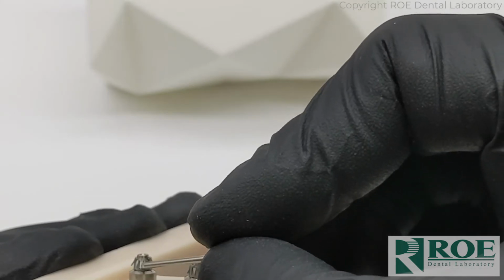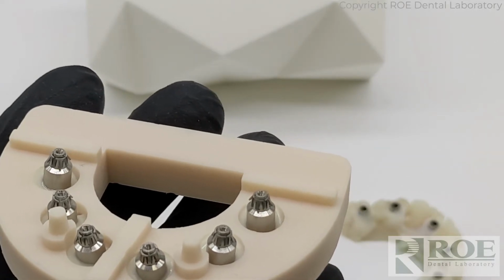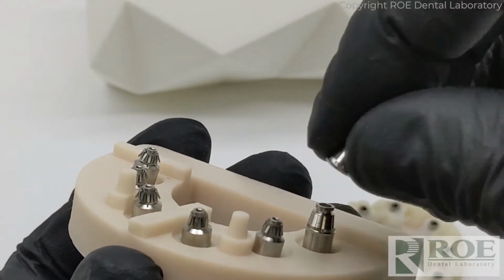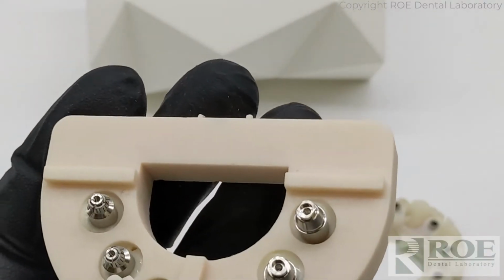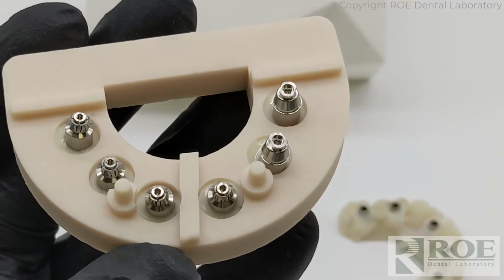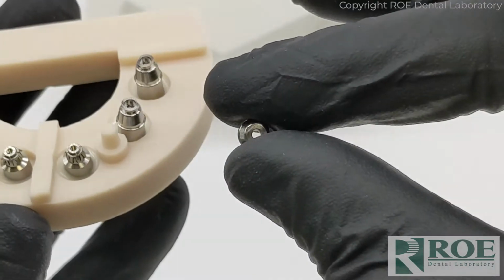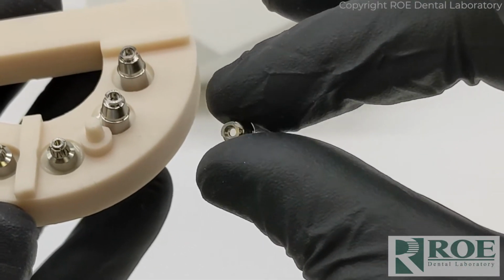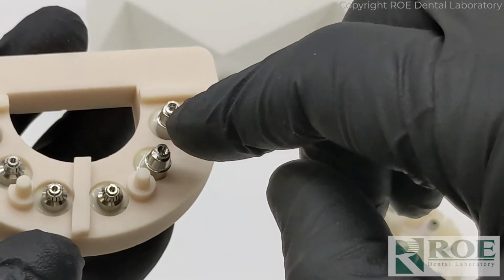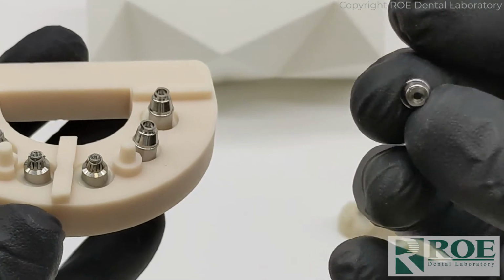See how easy that one spins? Some of them spin a little easier than others, but once they're all in, then we'll put the copings on top, like that. All 6. And one thing that is very important is that you see how these have an opening. They're developing some that have a closed top, but we need to block out that little coping so you don't get material down inside of the coping, because then the material will be down inside and it'll affect the Smilelocs. So we have to block out these little copings.